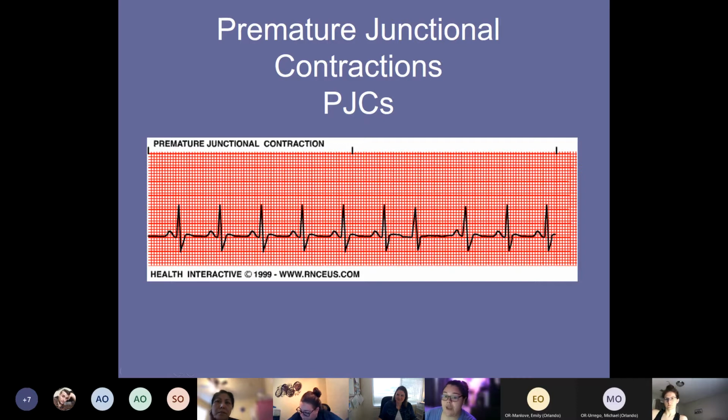So this one that you have up now, everything looks good except for one. Correct. But then the next one has the same features. It can be inverted, but they're more consistent, right? Yes. The difference is we have an underlying sinus rhythm here with just one. Sometimes there's two. I'm not saying it's always one, but we have a feature here.